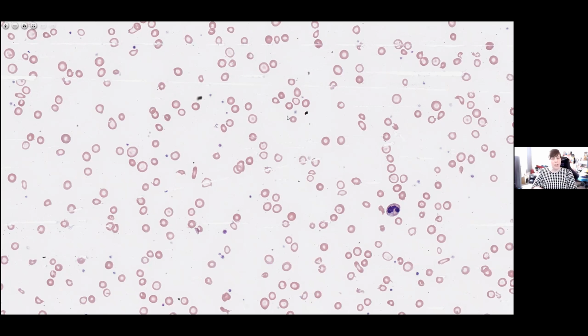Also, if you had available any results of a thalassemia screen, you could exclude the presence of a thalassemia or a hemoglobinopathy, some other type of disorder that might cause this picture. And the clinical details would be critically important. Is the patient actually symptomatic with anemia? Do they have a history of blood loss? Those kinds of clinical details could be important as well.